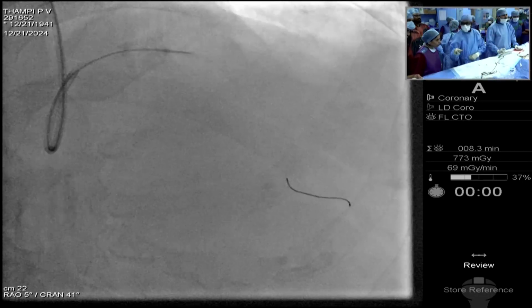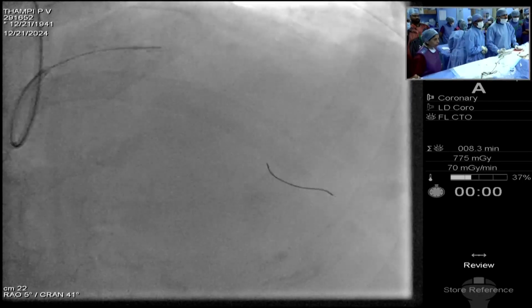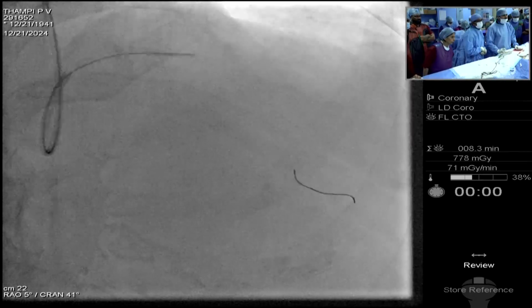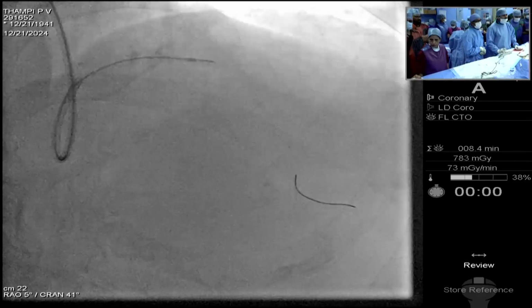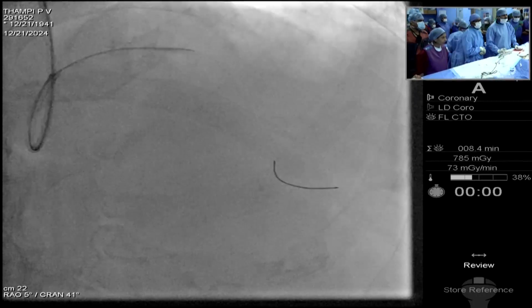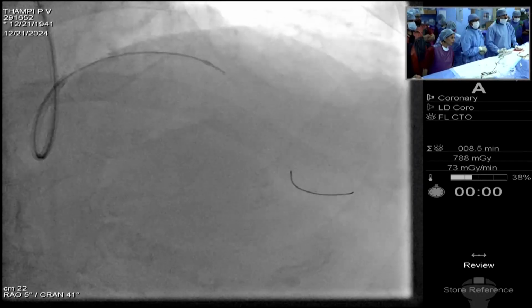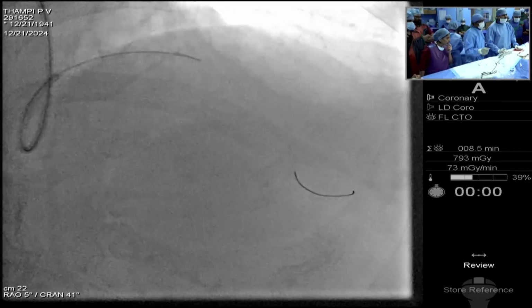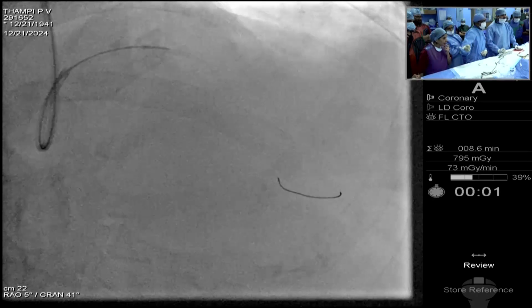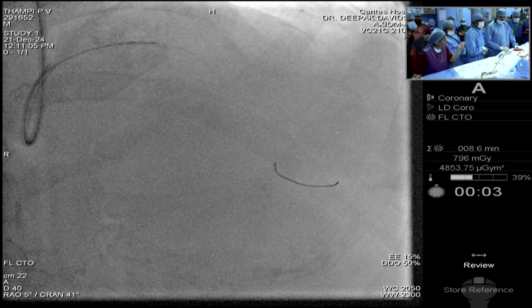Keep the Cine. It gives, come back. 25 seconds done. Okay, we'll come back and then halt.